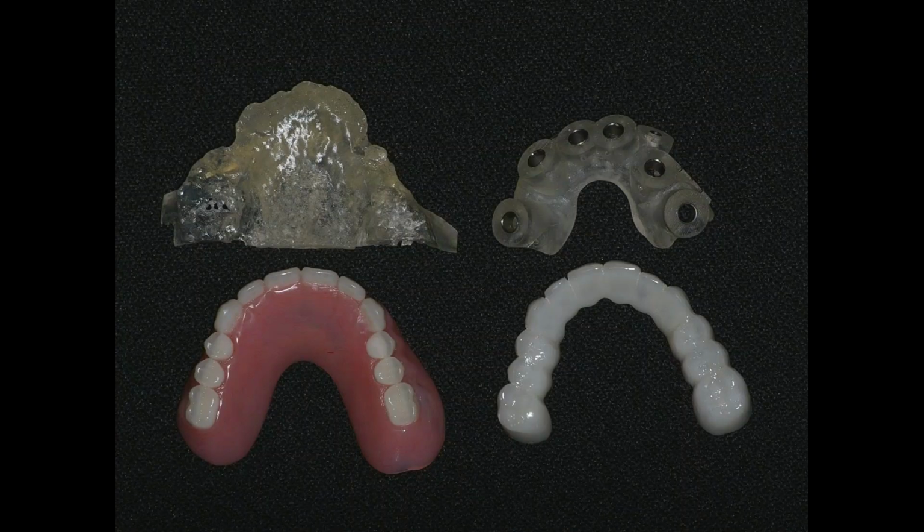The day of surgery, not only do we have our surgical guides available, but I always have two types of provisionals. I will always have an immediate denture just in case the quality of bone is not the most ideal and I can't load the implants immediately. If I can load the implants at the same time, then I will offer the fixed provisional restoration.